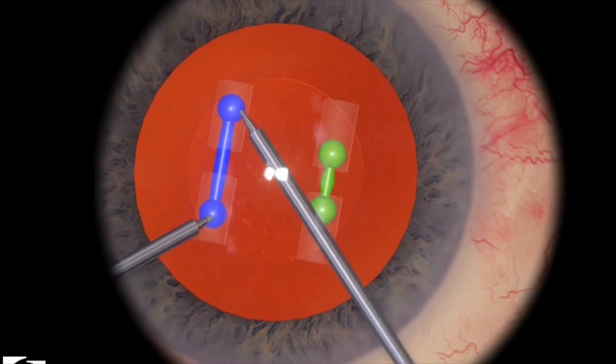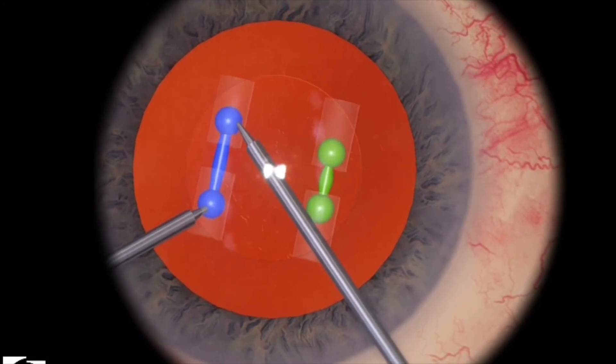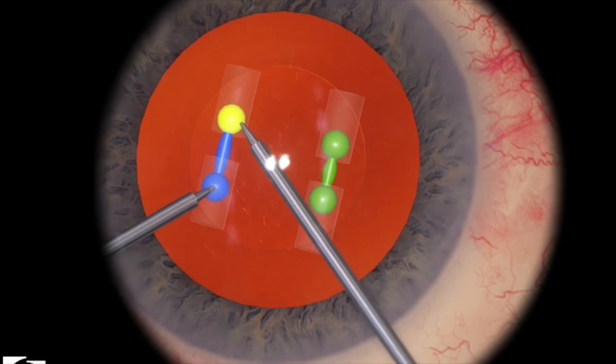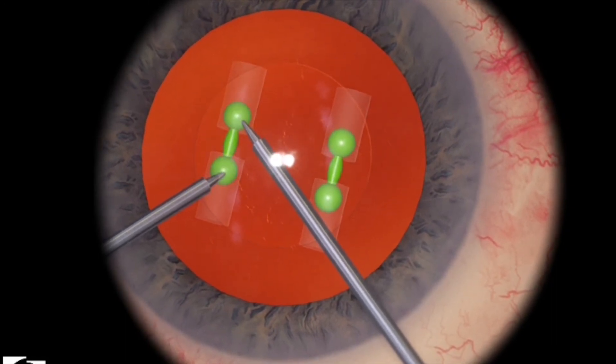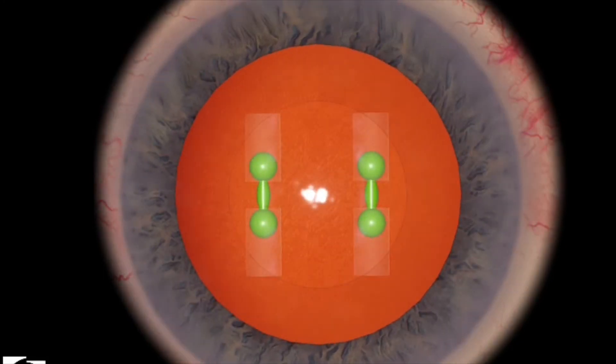And then here I'm actually being very careful because I know that my right hand is slipping a little bit outside the sphere, so I take some precautions to try to bury it a bit deeper. And so that was a perfect level.